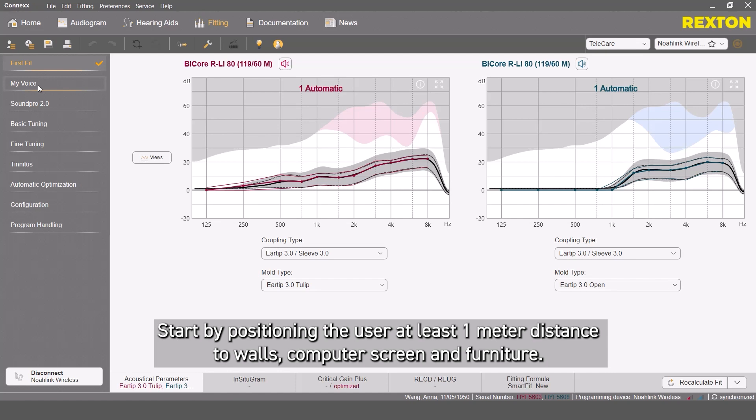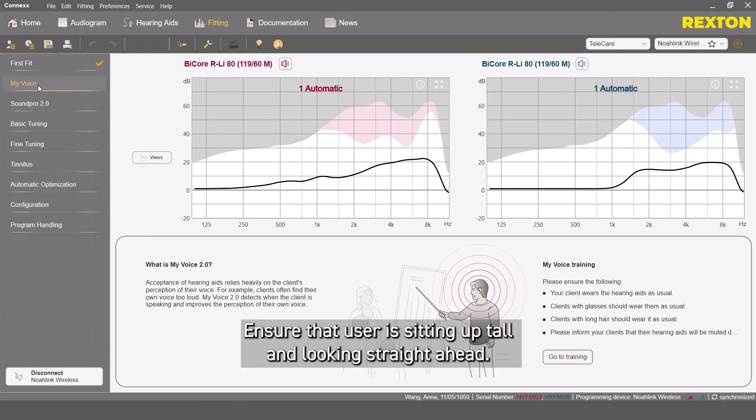Start by positioning the user at least one meter distance to walls, computer screen and furniture. Ensure that the user is sitting up tall and looking straight ahead.